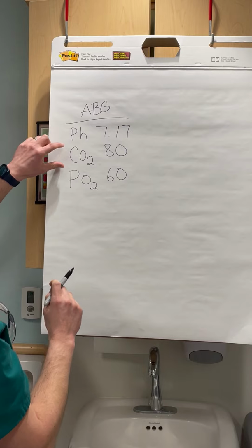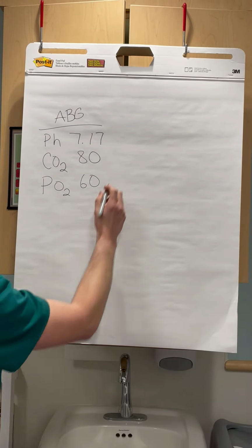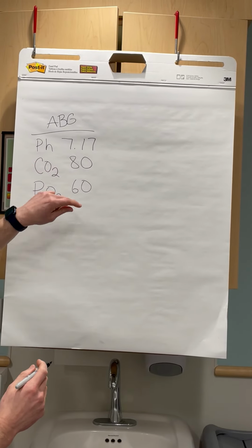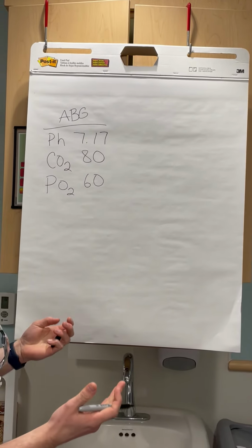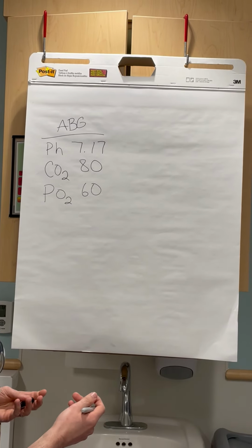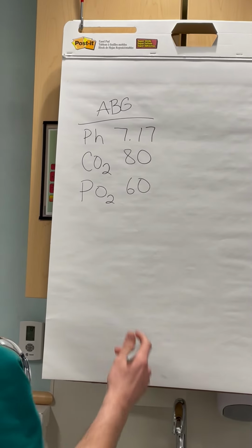So we can see here that our CO2 is a little high. Of course, our normal values would be 35 to 45. Especially with babies on an oscillator, we try to stay within a median of 50. So anywhere in the 50s would be acceptable, especially for premature babies.